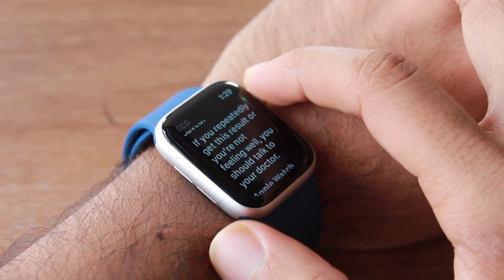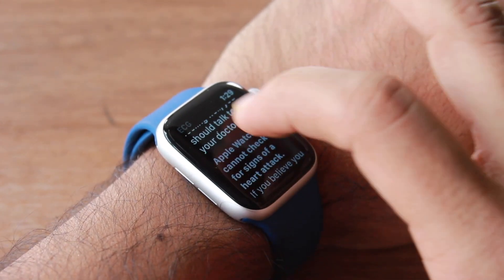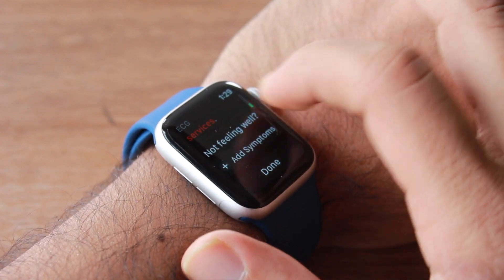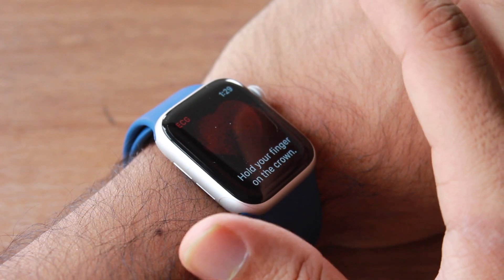The watch says that if you're feeling unwell you need to consult your doctor, and that the Apple Watch cannot detect the signs of a heart attack. If you believe you're having a medical emergency, contact emergency services. You can also add any symptoms and then press Done.